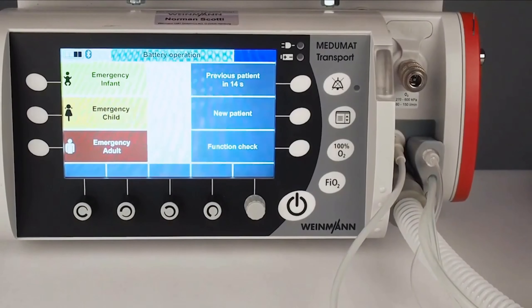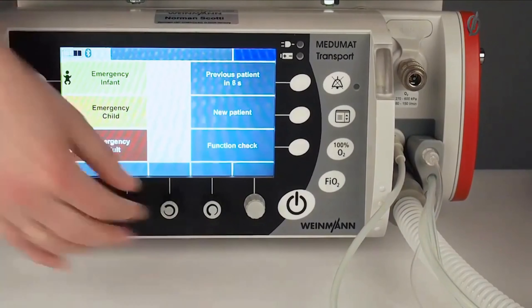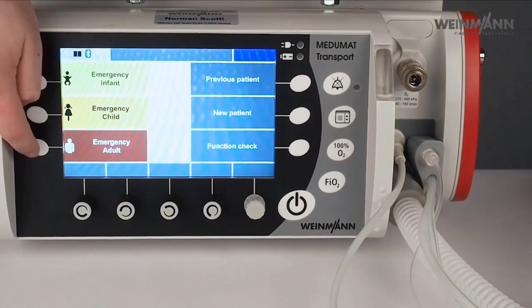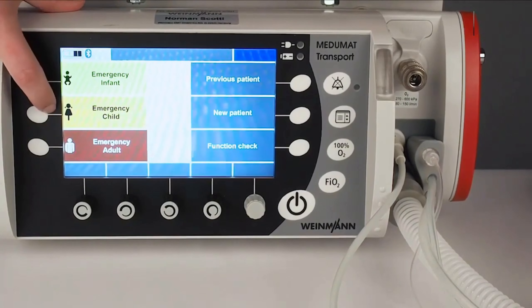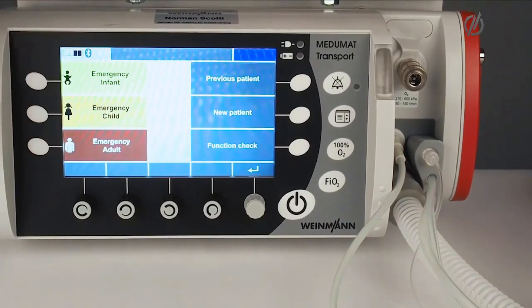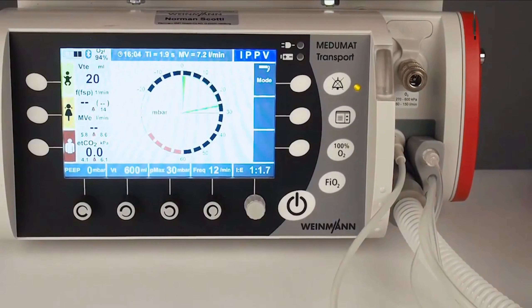After the function check, I would like to show how to start ventilation. One opportunity is via the emergency modes — this is a very fast way to enter and start ventilation. We have pre-configured settings for three patient groups: infant, child, and adult. You click on here and then press enter, and right now we are in emergency ventilation — volume-controlled ventilation — very fast and very easy, only for an emergency.